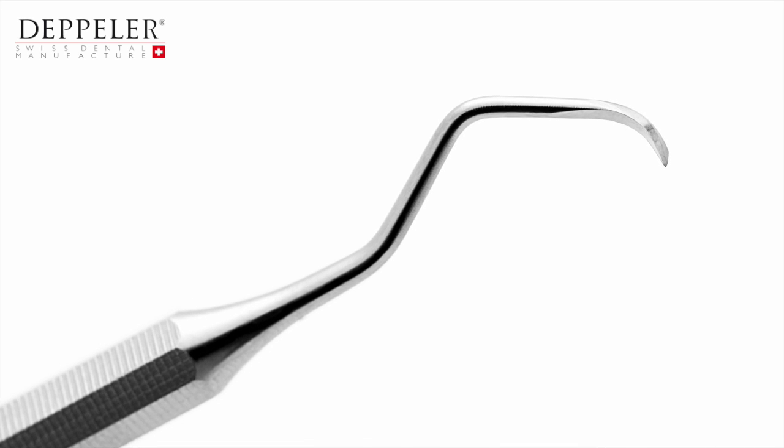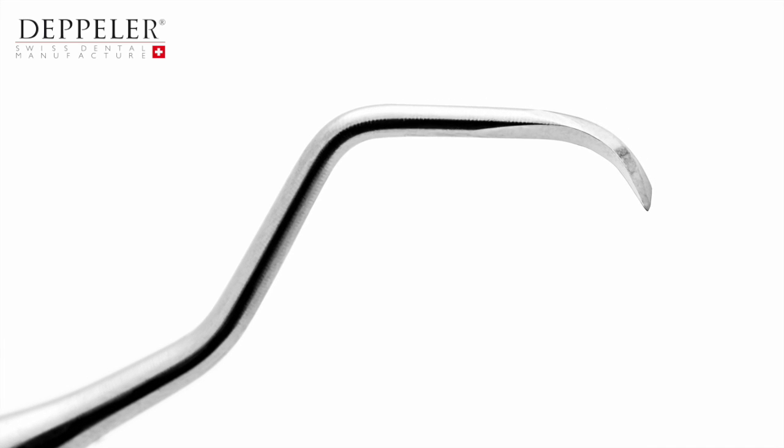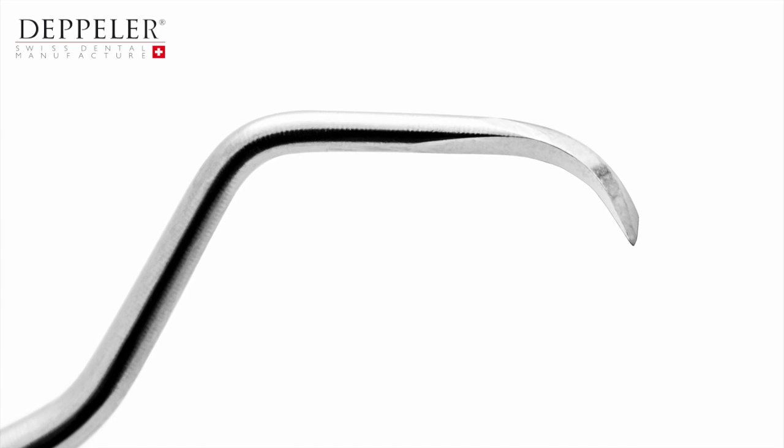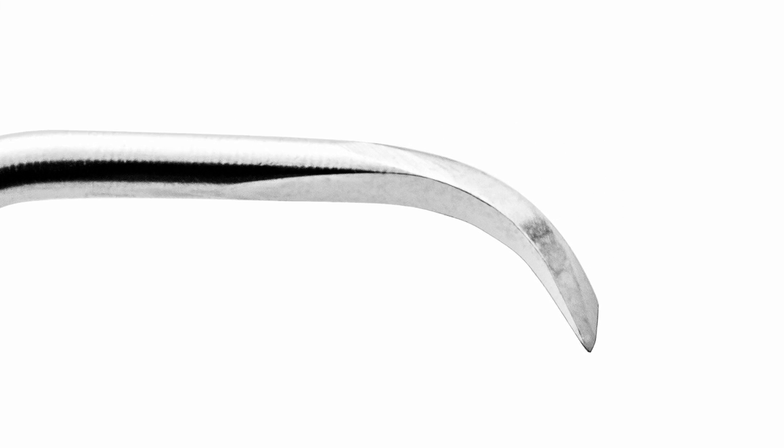After sharpening with the EasySharp you will obtain this result. Don't hesitate to look at the tips of your instruments with the magnifying glass to check their state before and after sharpening.